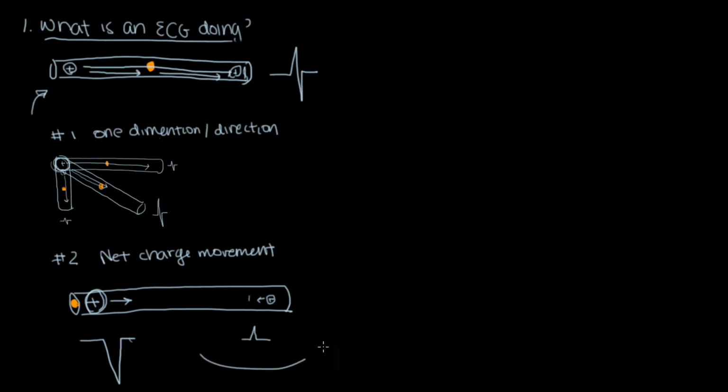And what ends up happening then is the sensor will display the sum of both of those together, right? So it won't be quite as large of a negative deflection moving away as this larger charge, but basically you don't see this small charge going through.